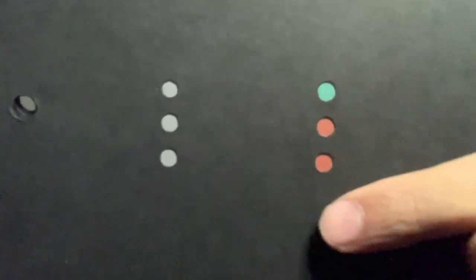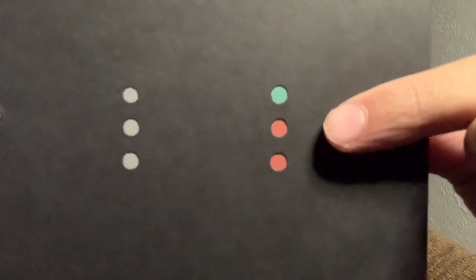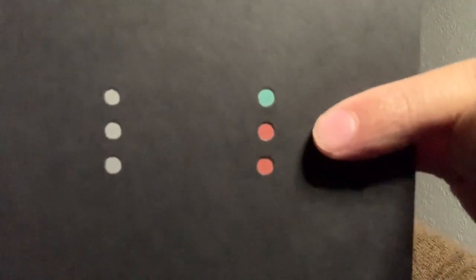On the first plate, for normal colour vision they all look the same shade. All subjects regardless of colour defect should answer that the top looks different in shade to the other two. For the bottom left, normal colour vision should say they all look the same shade. For the next position, normal colour vision should answer the middle looks different in colour to the other two. If you had a tritan defect, you may miss this one.